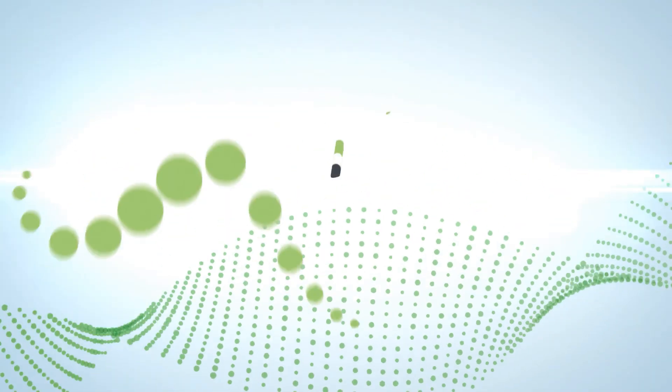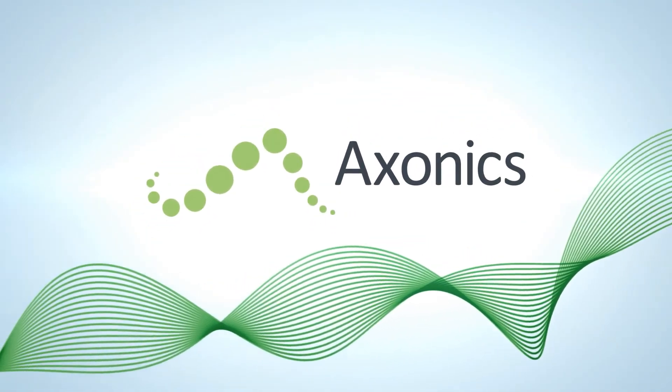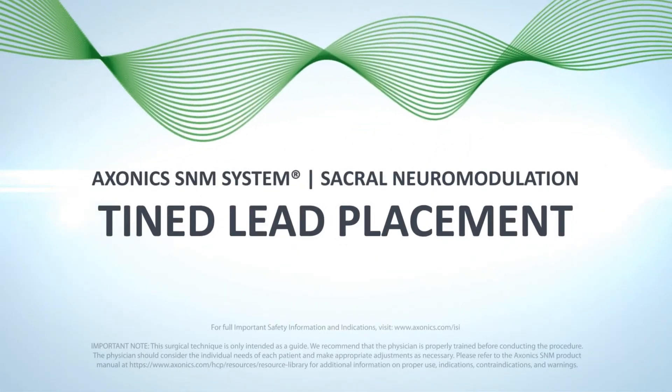This concludes the placement of the tined lead, which is now ready for the advanced trial or stimulator procedure.